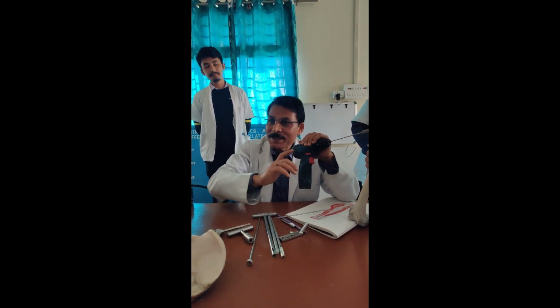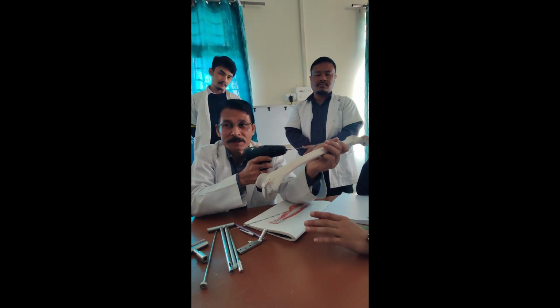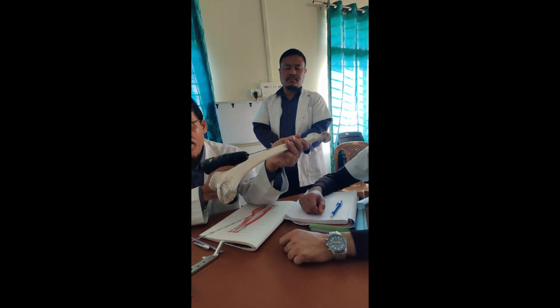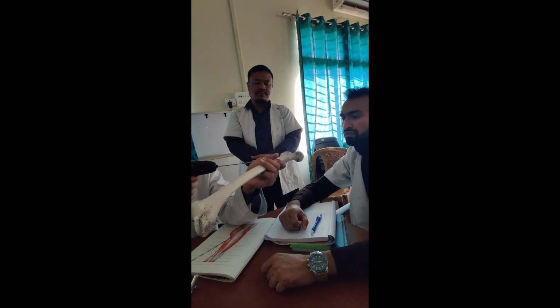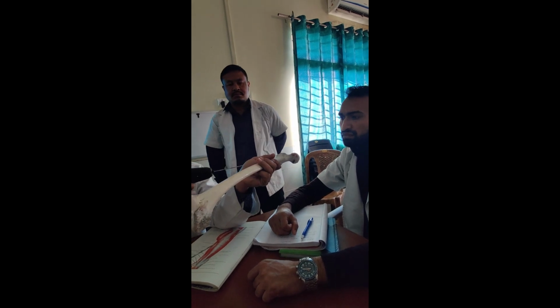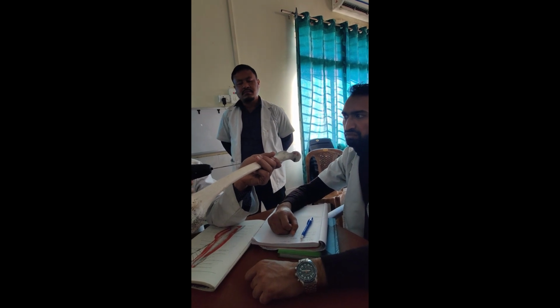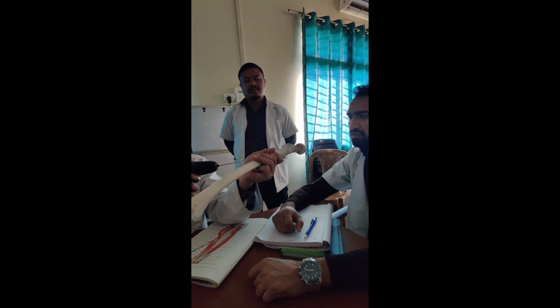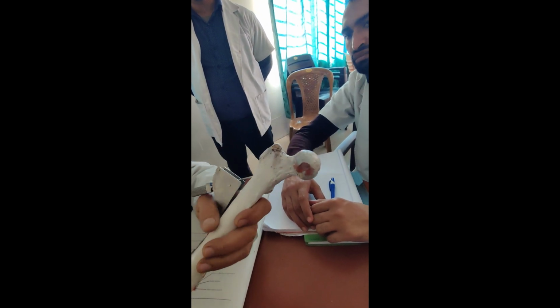Otherwise, you have to think that you have to correct this. So this is almost like this, and immediately you have to go down below. So correct the anteversion. Your aim is here, parallel to the bone. Then I have to be like this to maintain the anteversion. So initially you go. Now halfway, you wait.